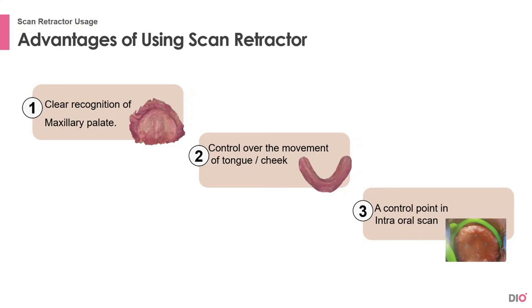First, it helps recognize the maxillary palate clearly. And second, scan retractor controls the movement of the tongue and cheek of mandibular. And last, it controls the point in the oral scanner.